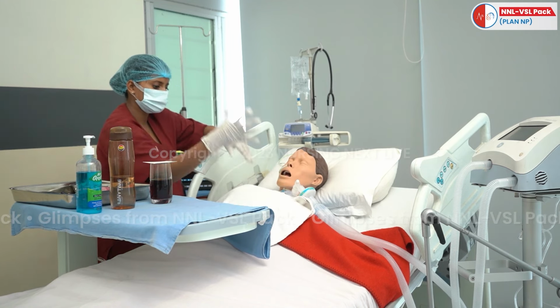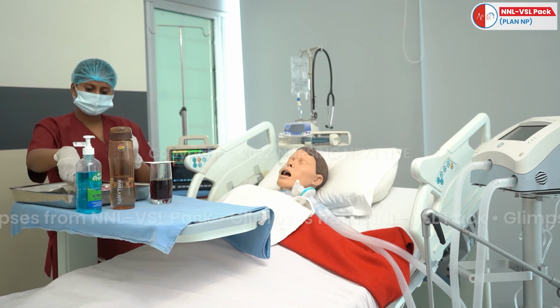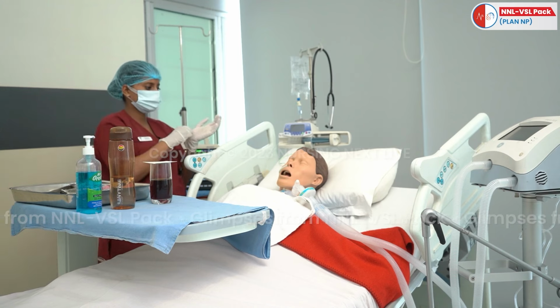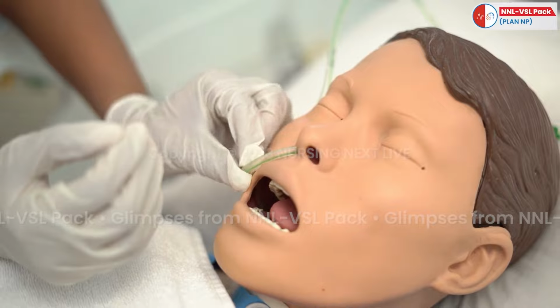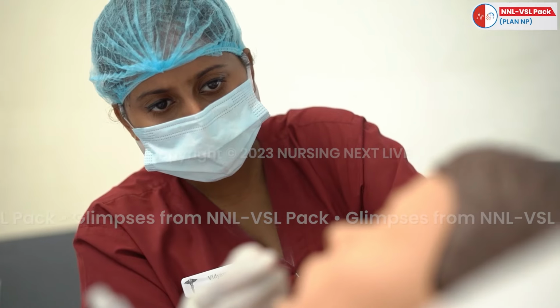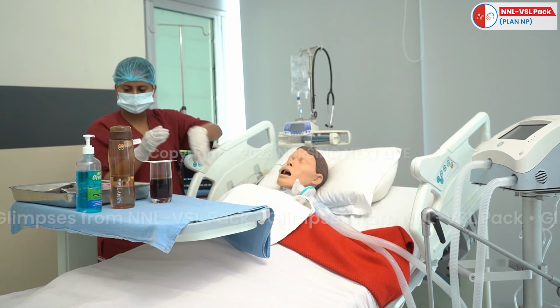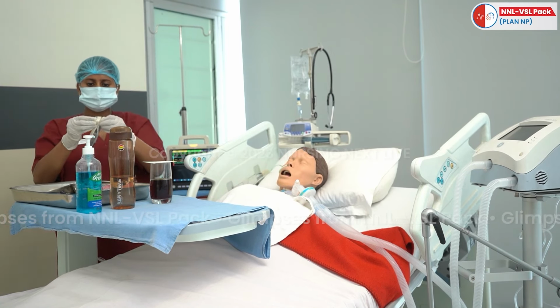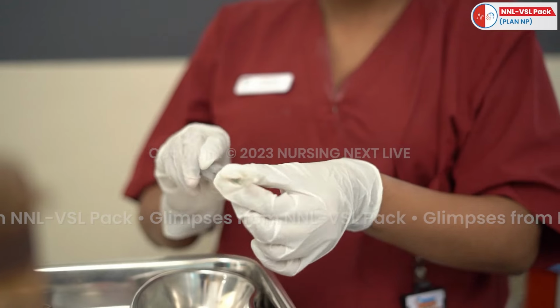Check the NG tube placement by these three methods. First, inspection. Check whether the tube is not displaced by checking the measurement calibrated on the NG tube, which should ideally be between 50 to 60 cm. If it is less than this measurement, you have to immediately consult the doctor.